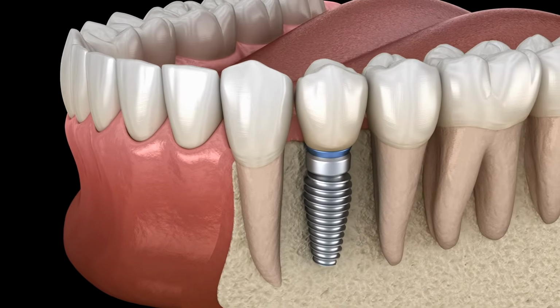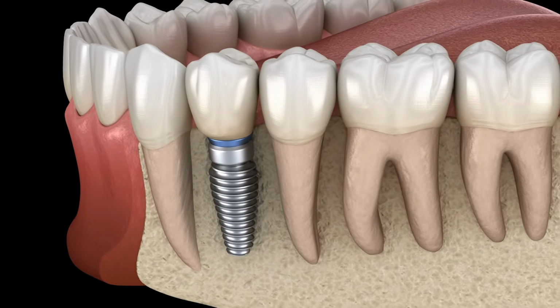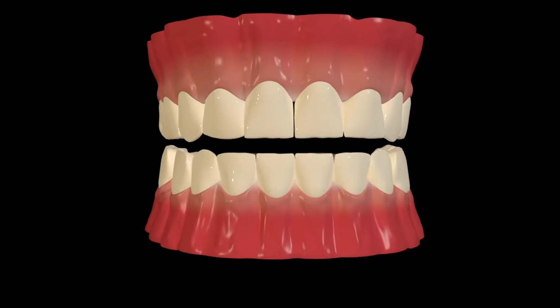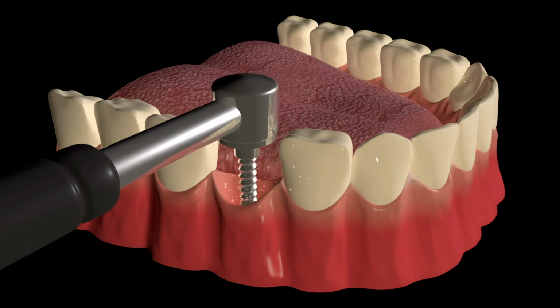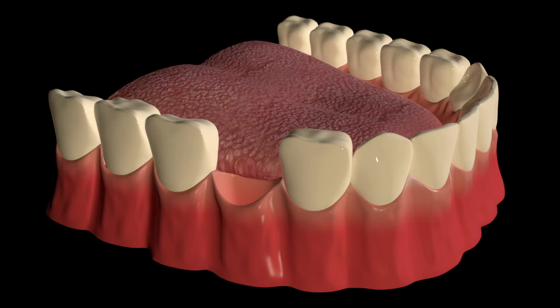overheating. Implant installation. A titanium dental implant, engineered with a special surface texture for better integration, is carefully threaded into the prepared site. The implant is positioned at the precise angle and depth determined during planning. The surgeon uses a calibrated torque wrench to ensure the implant is stable, which is crucial for successful healing.